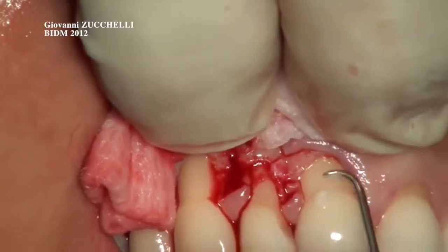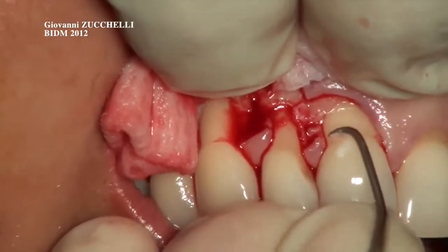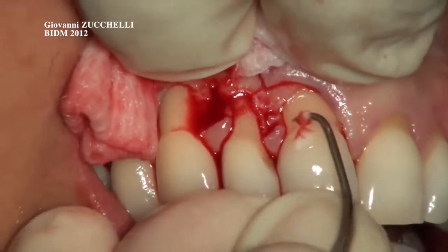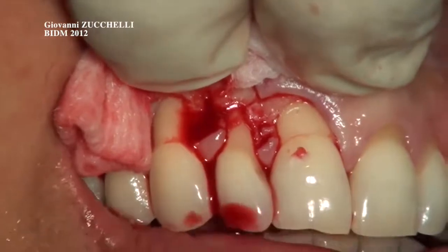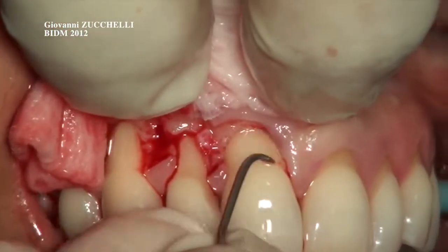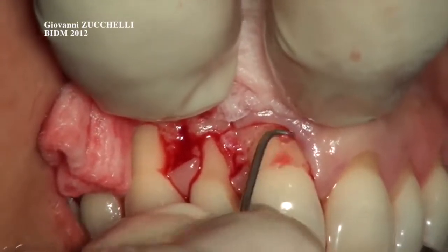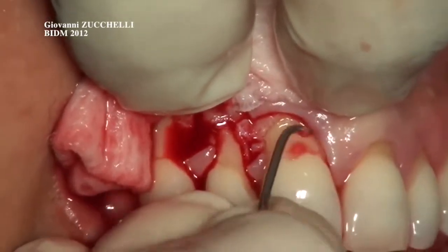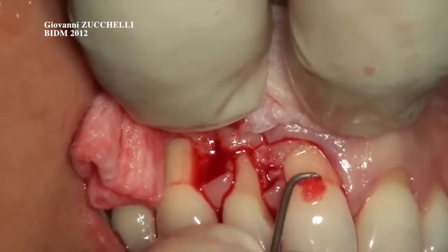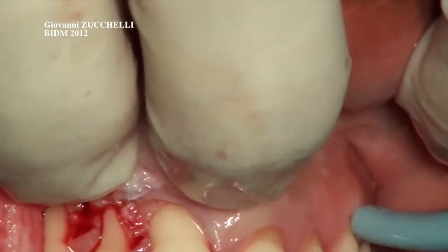They are quite soft, and the root, so we have to make root planing until a very smooth, hard surface. It sounds hard, okay? Now I'm going to do the mesial aspect of the central incisor. Suction inside sometimes. Inside. Open please.